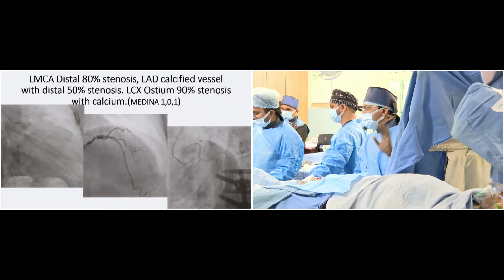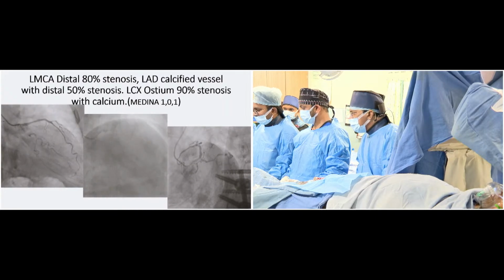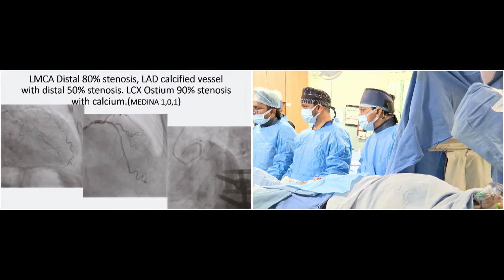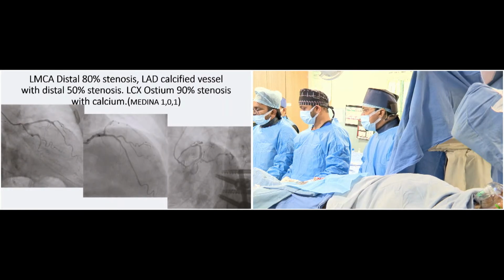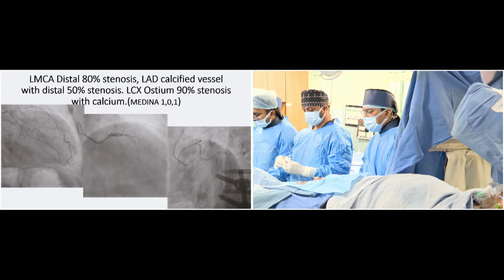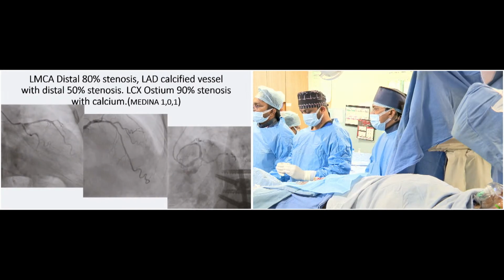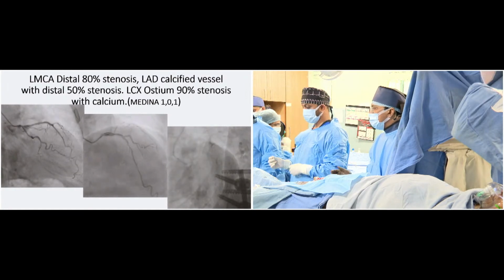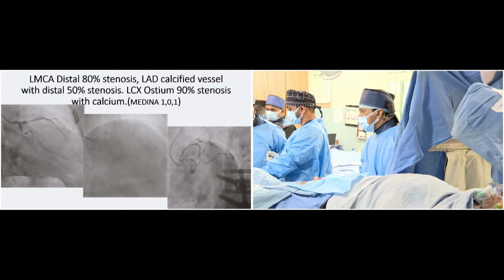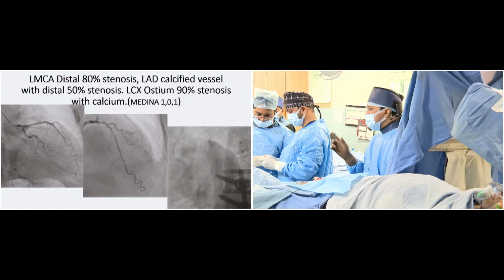So here, using the ROTA Pro, the advantage is you don't have any foot pedal, no need to press again and again. It is simple, handy, and very easy to operate compared to the previous one. The previous ROTA needs a lot of coordination. Here you have to press with a foot pedal, you have to press even for the DynaGlide if you want to switch, and simultaneously you have to coordinate. Here you only press the knob so that it will be on.